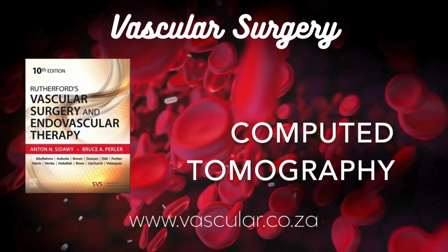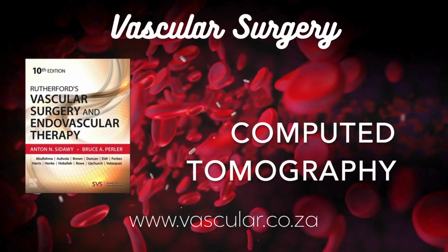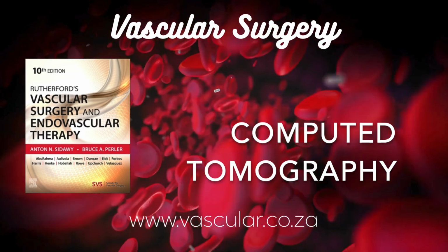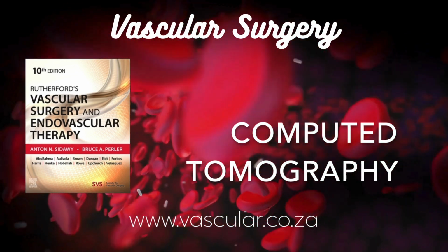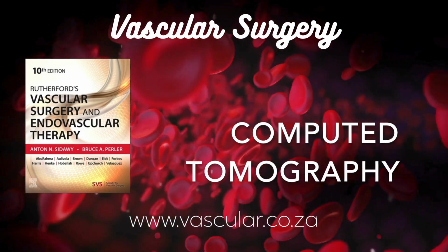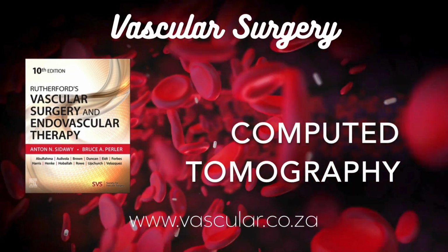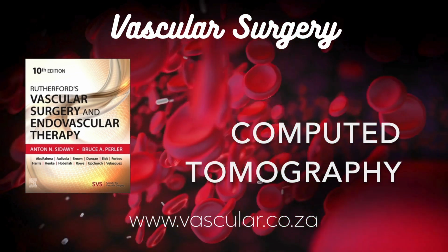Okay. They take quick, low-dose monitor scans at one specific level, say the aorta. The software watches the HU value in that vessel. When it jumps up to a preset threshold, meaning the main bolus of contrast has arrived. Bang, the main scan starts automatically. Exactly. It triggers the full diagnostic spiral scan at just the right moment. That's pretty smart. What about the contrast itself? What do they need to think about?